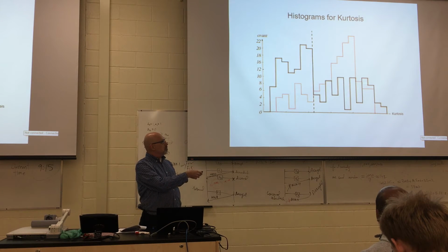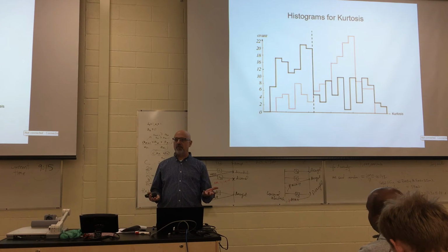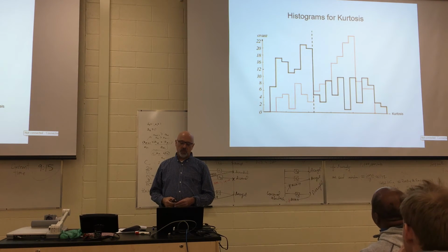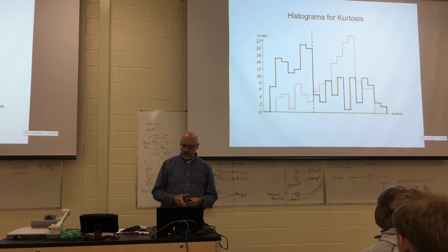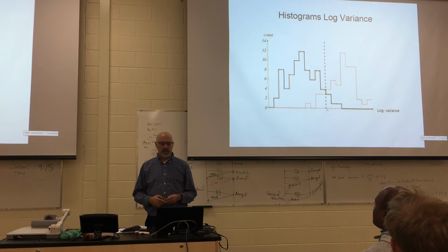So all of this pink was classified correctly, but then the error that was misclassified is to the left of that. So we take the count of that and divide it. We take the total counts here and divide it by the total count to get what the classification error rate would be for bad signal. So as we can see, this is not a very good classifier, right? It's got a high error rate. So can we do better? So let's look at variance, right?